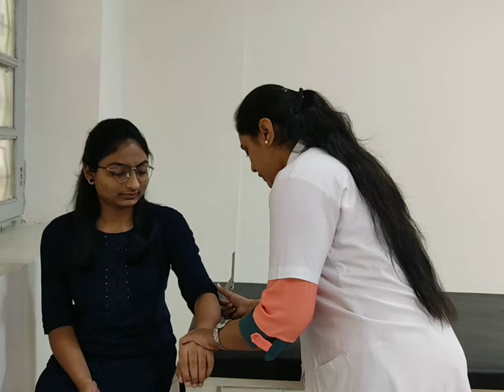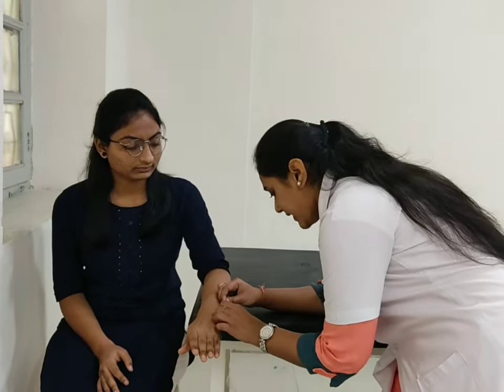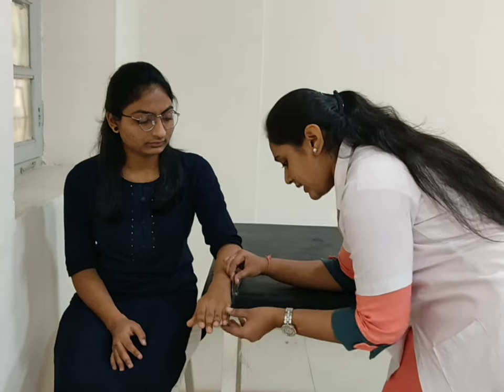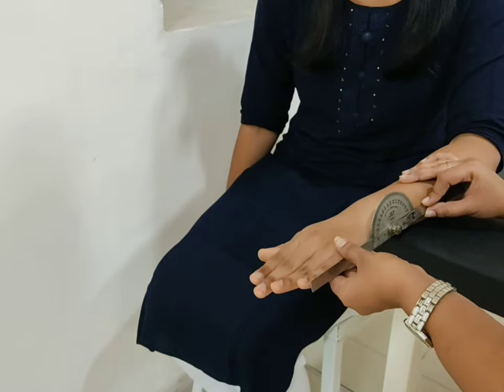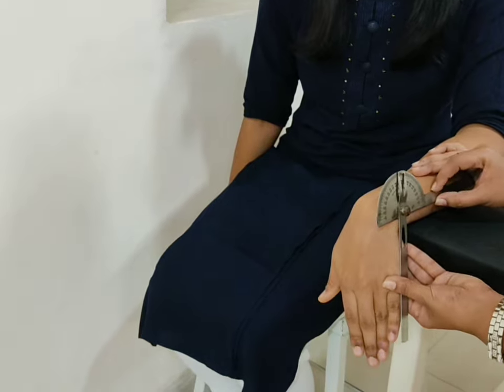For wrist flexion, patient position sitting on a chair. Fulcrum at the ulnar side of the wrist. Forearm resting comfortably. Stable arm at the medial aspect of the forearm and movable arm accordingly. Ask the patient to move your hand down towards the floor. Normal wrist flexion is 80 degrees.